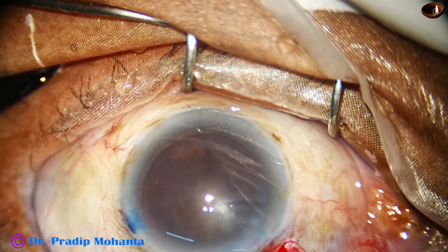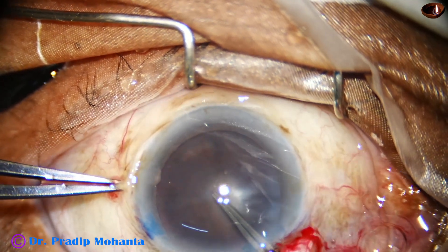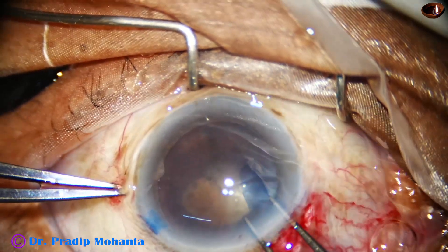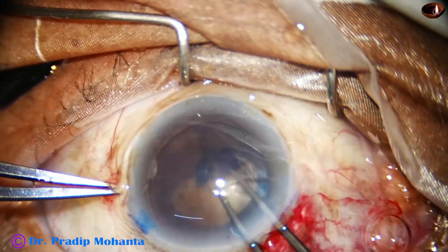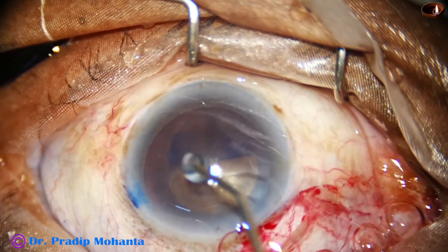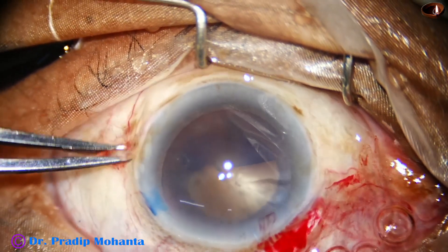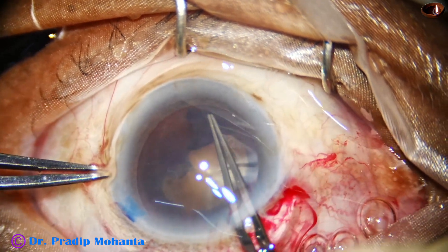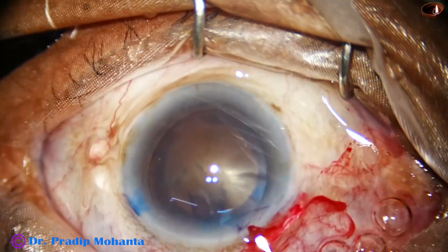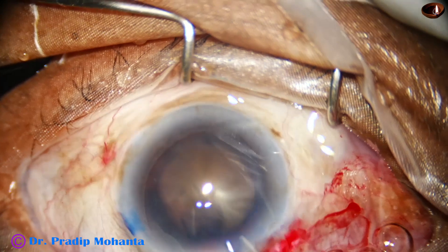I did a little bit of peritomy because I knew there is going to be too much conjunctival swelling, so a bit of peritomy has been done. And now capsulorhexis. The size of the capsulorhexis is going to be about 5.75 millimeter, almost 6 millimeter, because in hard cataracts, if we do a small rhexis, management of the pieces, large fragments, and cracking the hard nucleus becomes very cumbersome. It is always better to get a rhexis of this size in hard cataracts.